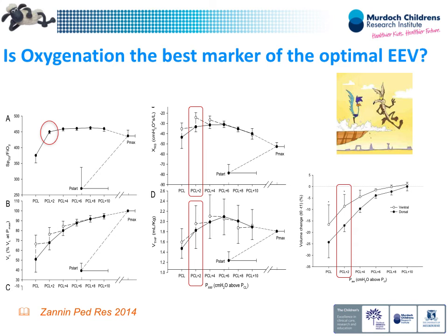When we look at markers of lung mechanics, tidal volume and lung reactance using forced oscillation measures, we can see that these parameters very closely define the point where heterogeneity of de-recruitment is becoming predominant and the cliff occurs. And in fact, there's a U-shaped relationship such that a couple of steps back from the cliff is where these markers are often best.